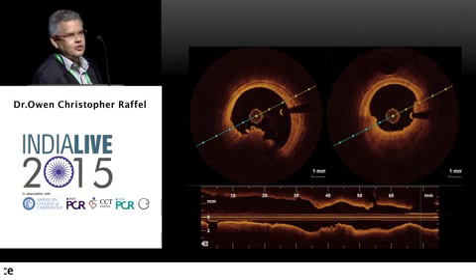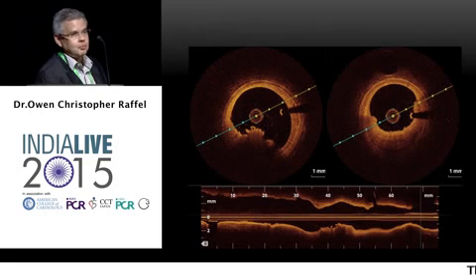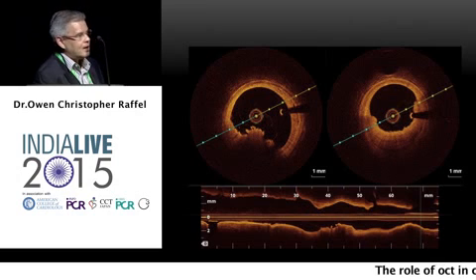So this OCT actually made a clear diagnostic decision. It wasn't spasm, it was actually an ACS with plaque disruption due to plaque erosion, with a secondary spasm because of all the vasoactive issues. So the treatment for him wasn't verapamil, but it was ACS treatment, dual antiplatelet therapy and secondary prevention therapies. We didn't stent him.